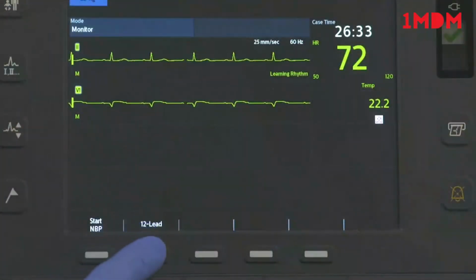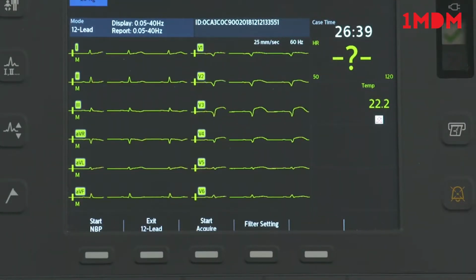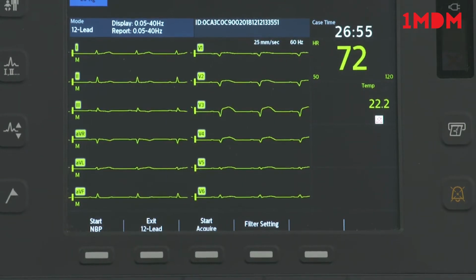In addition, the 12-lead function provides computerized ECG analysis using one of 2 acute myocardial infarction (AMI) detection settings for the DXL algorithm. The standard setting is the default setting and provides the standard Philips DXL algorithm acute MI sensitivity setting found in Philips patient monitors and cardiographs.